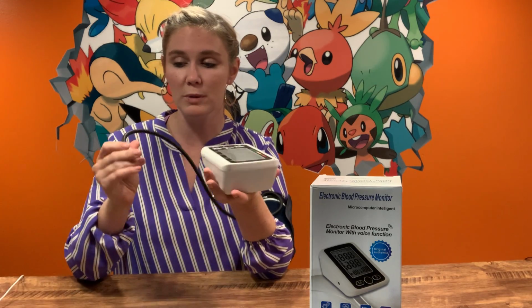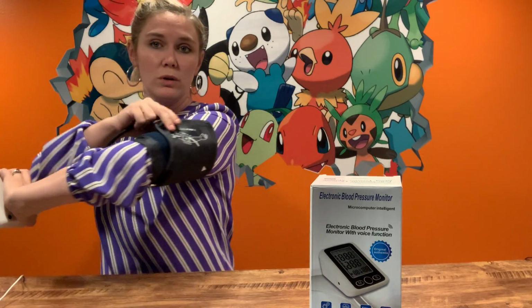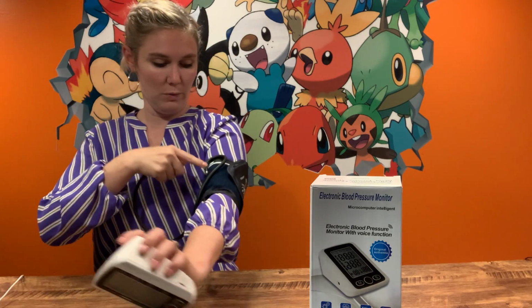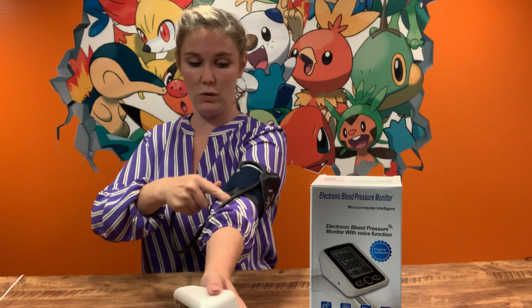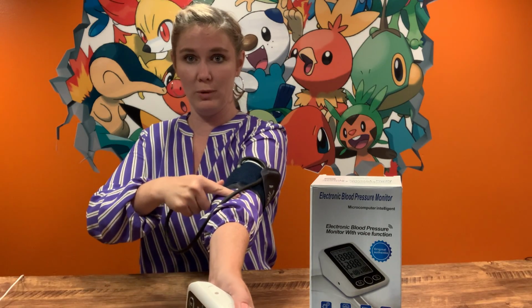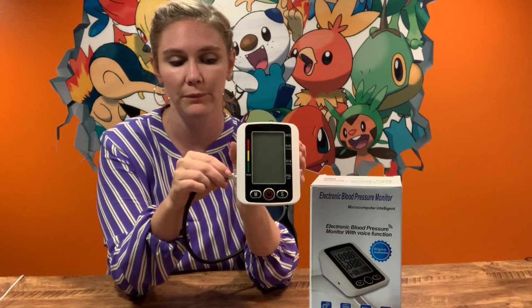So hooking it up is super simple. You put the cuff on your arm. You want to make sure that this arrow is facing your shoulder, and then you want to make sure that the tube is right in line with your artery. So you should be able to feel the inside of your elbow right here, and the tube should line up with it. And then you take the tube on the other end and plug it in this hole right here.